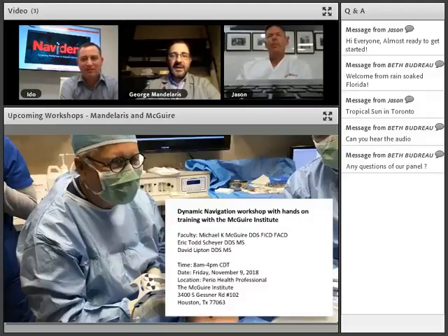I absolutely do. As much as I love you guys, and I think you've made great strides, the head tracker, I feel, is a bit obtrusive. It's easy to hit. So I see myself probably in the future using the jaw tracker. As long as you're aware of the head tracker and you're not hitting it, you're in good shape. But if the circumstances are more applicable to using the jaw tracker, it's simple to attach, and I will be using that. So I think it depends on the operator's preference.